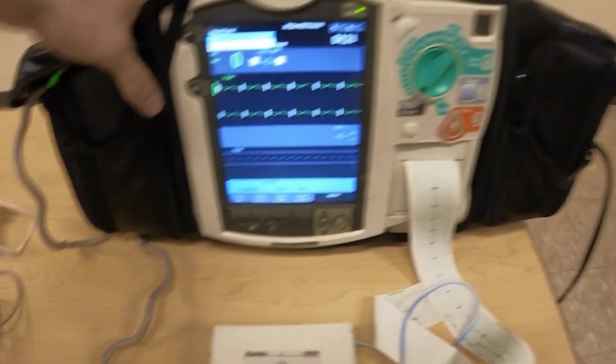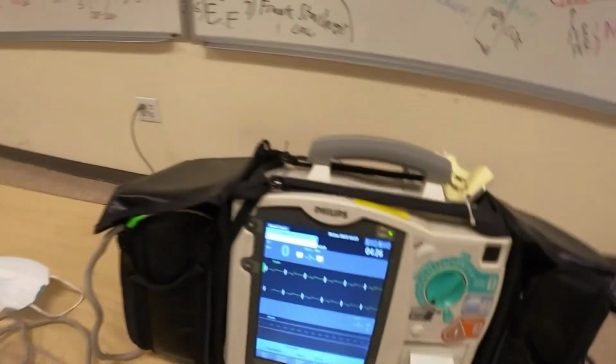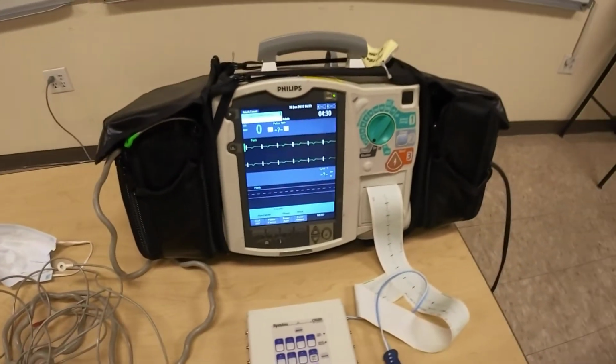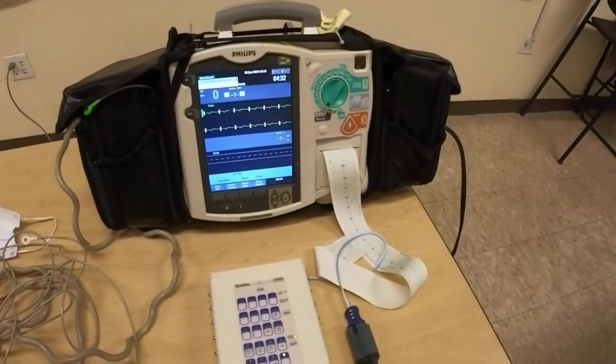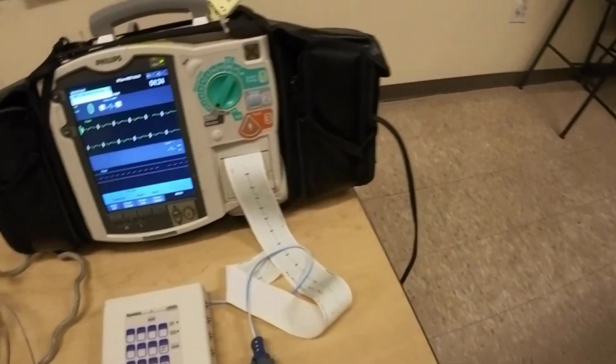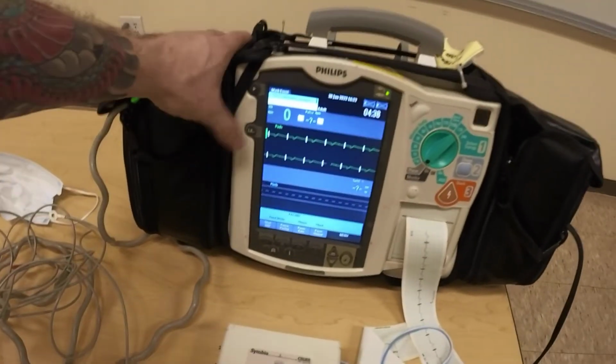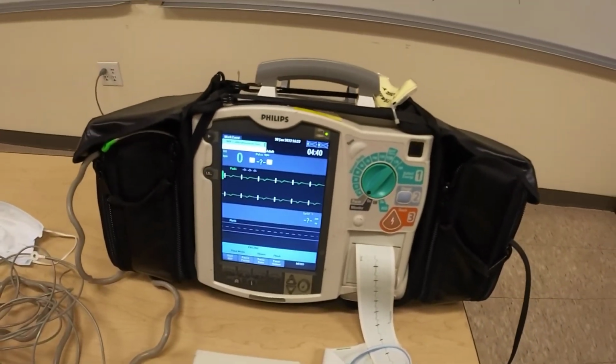even if you cycle through all the leads with this button, and you cannot see anything. The other reason, you have no limb leads. You forgot your limb leads. You didn't inventory your vehicle, so you only have the pads. Or your R wave is not very prominent. I cycle through all my leads, and my R waves... Let me show you what I mean by that.